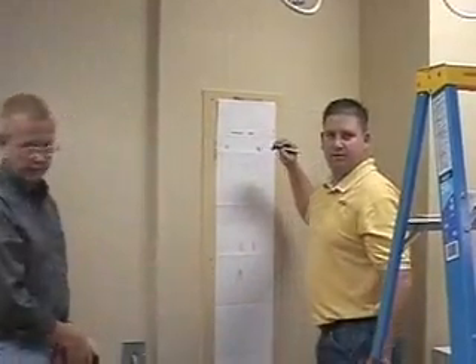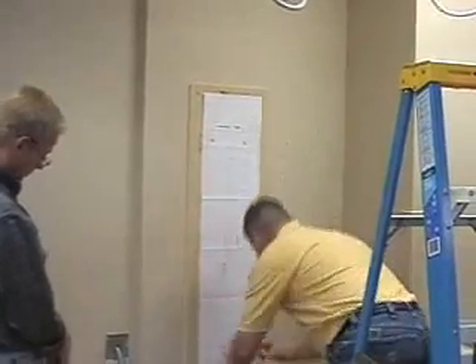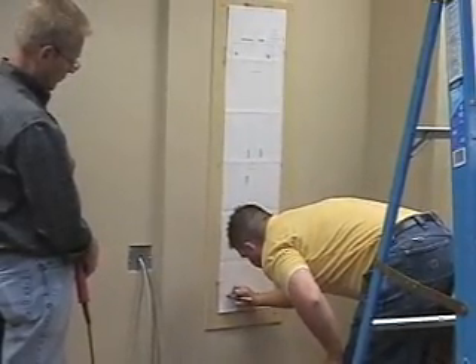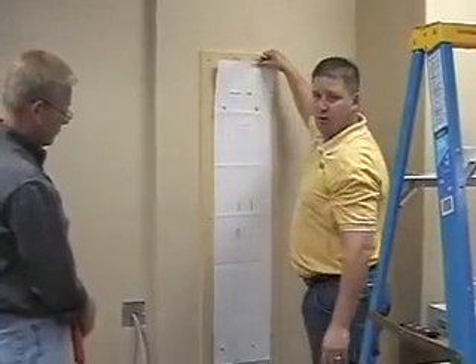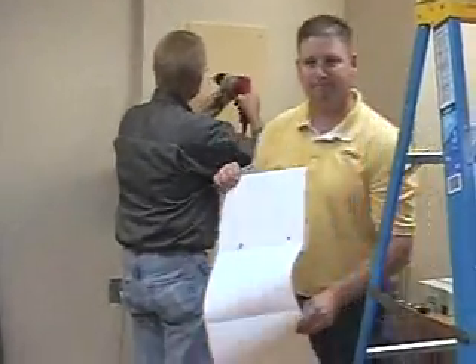We're just marking the plate and the templates — there are holes where we're marking the center. Then we take this down and drill. Once drilling is complete, we tap the holes.